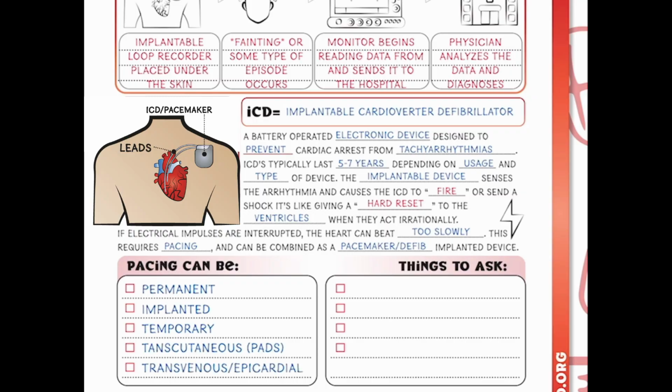And there's also transvenous or epicardial pacing. And this is going to involve leads that are going to be threaded through the veins of the heart, while epicardial pacemaker leads are attached directly to the heart surface.